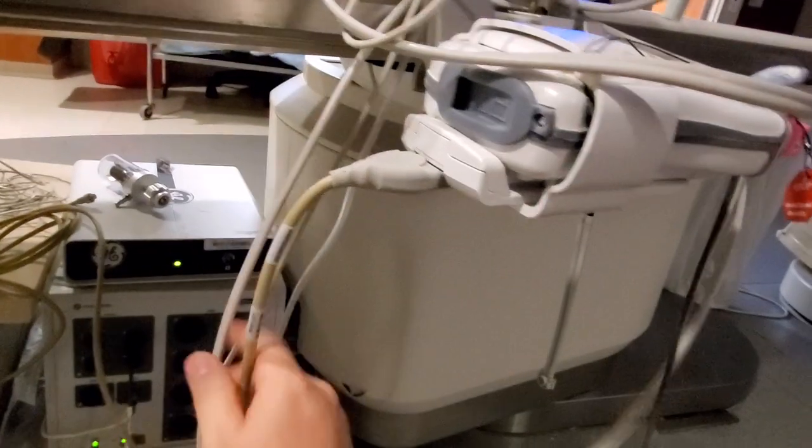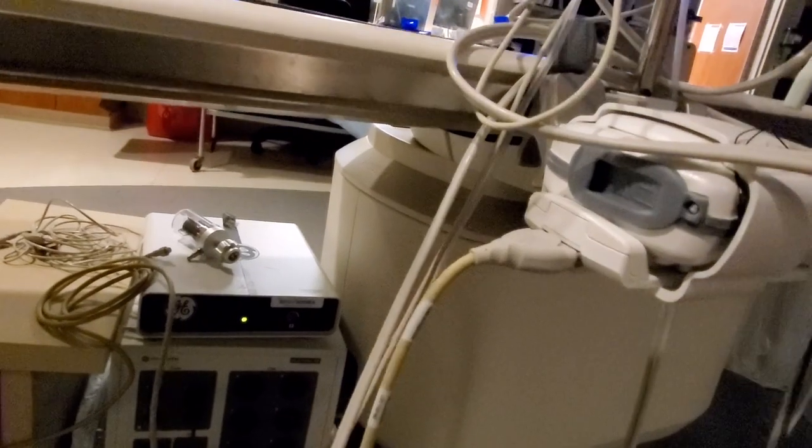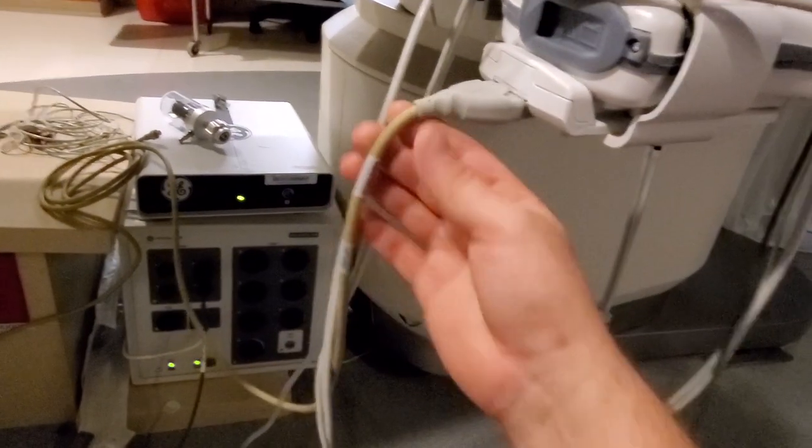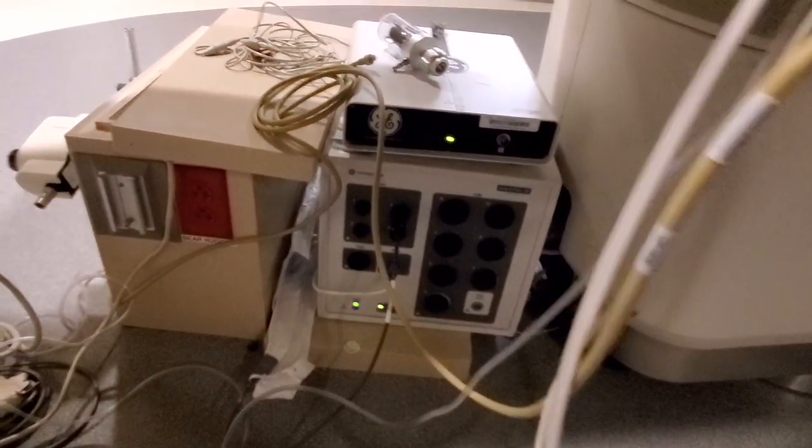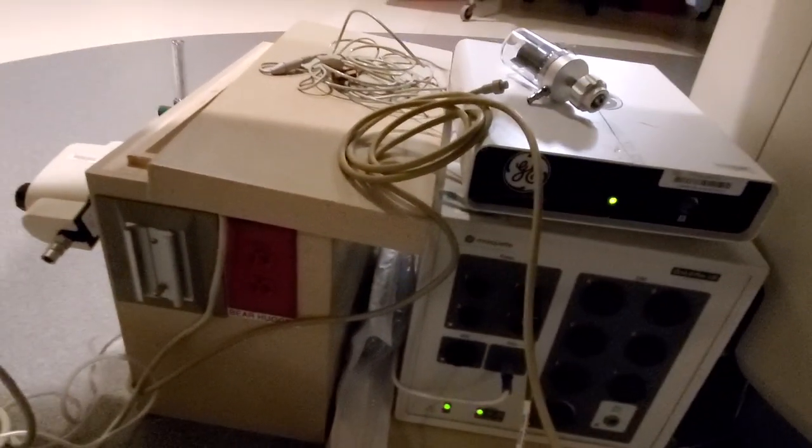So a couple of the other things I want to point out. We want to make sure that there's no yanking on cables. You can see this one here is wound around some other stuff. And this one is probably going to get pulled out when they start goofing around with all this. I mean, look at this. This is the end of the day type of scenario. People just want to get the hell out. I got some stuff thrown up there.